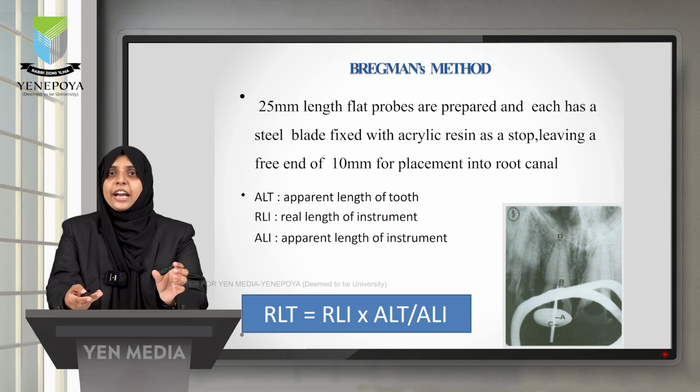So leaving a free end of 10 millimeter for placement into the root canal, you take a radiograph, after which the real length of the tooth is measured by real length of the instrument into apparent length of the tooth by apparent length of the instrument.